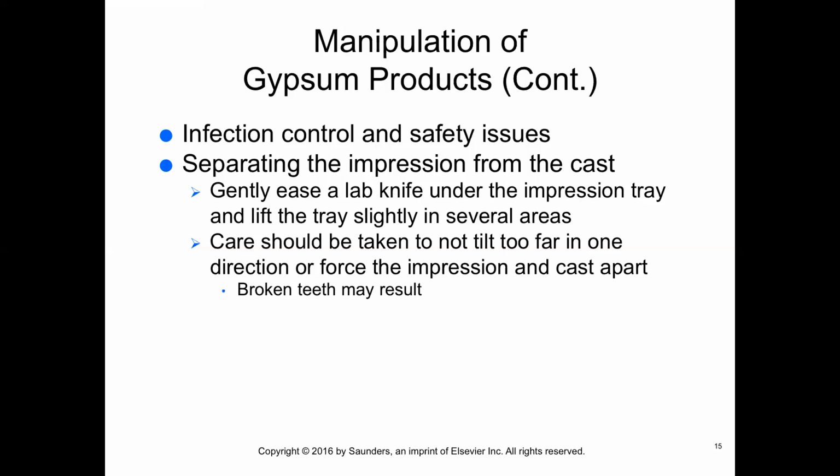On setting of gypsum, the impression tray and the cast must be separated. When the impression is poured, care should be taken to make sure the gypsum does not flow onto the tray, locking it into the set gypsum.